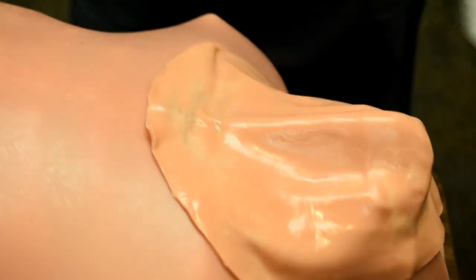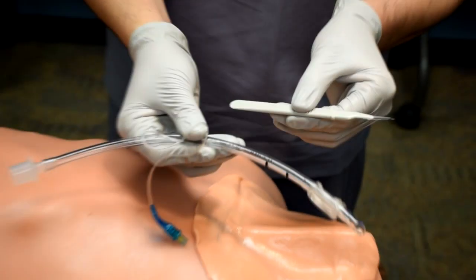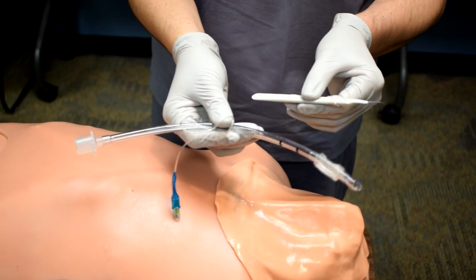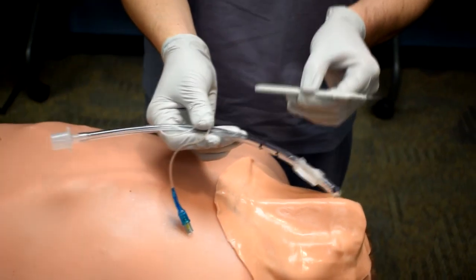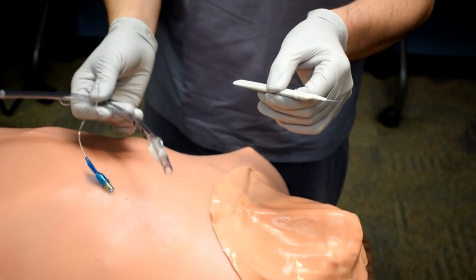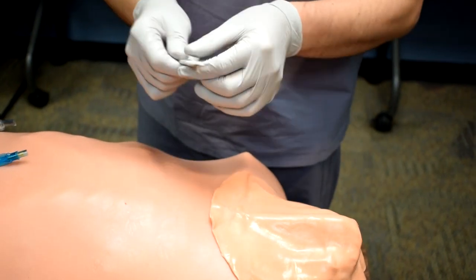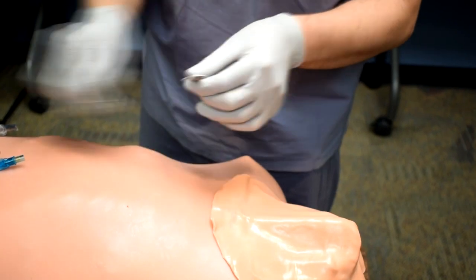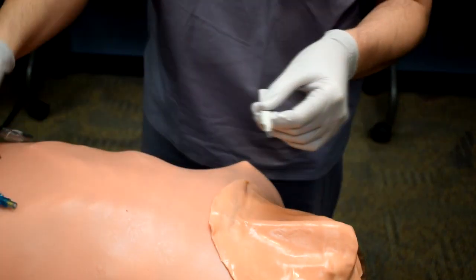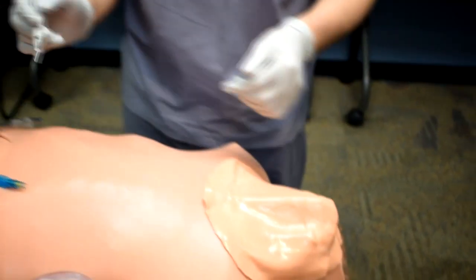In this example, we are only going to use a knife and an endotracheal tube. Minimal equipment that you need for a surgical cricothyroidotomy. Again, this is a 6.0 tube. I would recommend a 6.0 or smaller. And then you can use any knife. Here we're going to demonstrate it with an 11 blade. And remember, you want to cut away from yourself. For the dilatation, because this is the only equipment that I have, I'm going to use my finger. So a knife, an endotracheal tube, and using my finger for the dilatation. And that will allow us to do this procedure with minimal equipment.